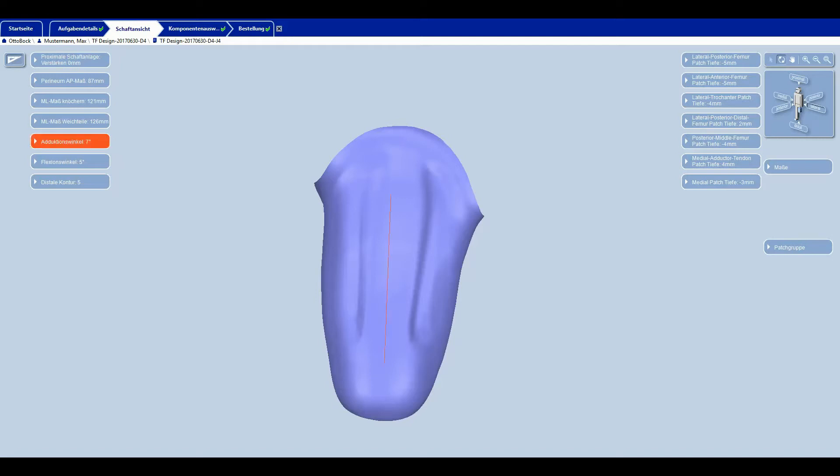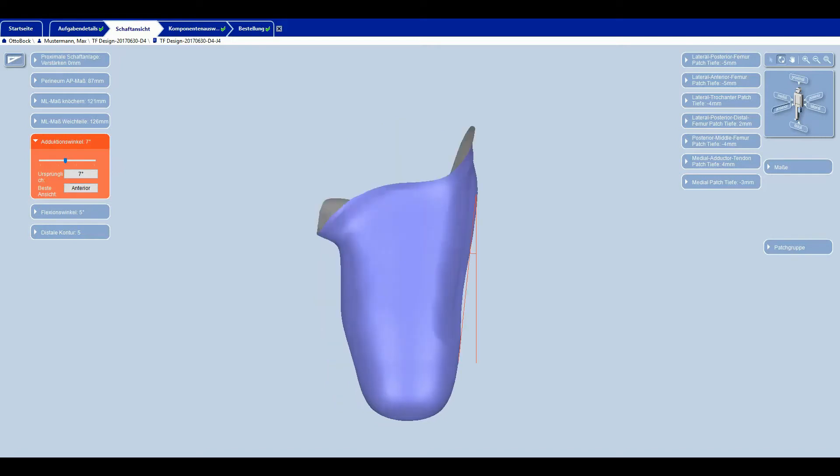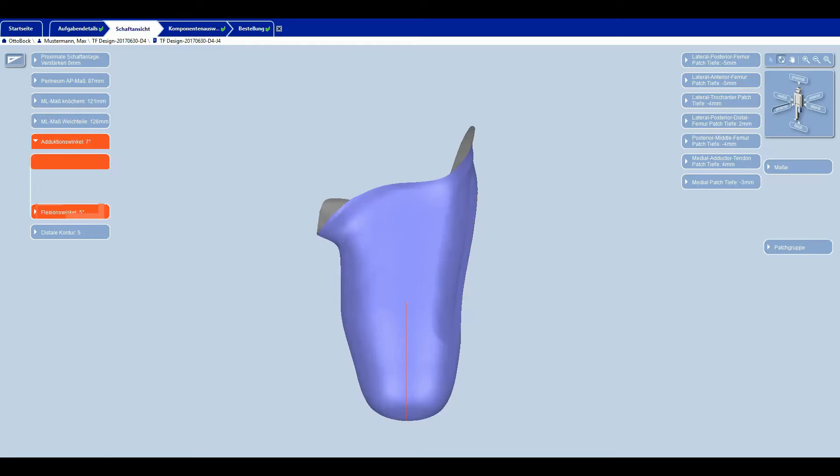The adduction angle is determined in relation to the natural socket wall and not in relation to the longitudinal axis of the residual limb. I can use the position of the socket in the 3D view for orientation when checking the adduction angle. This is often a better indicator than the value of the displayed adduction angle. The model is always pre-flexed by 5 degrees in the sagittal plane.